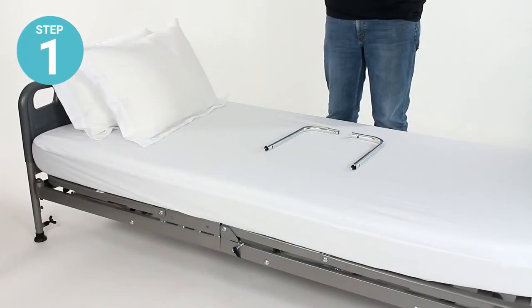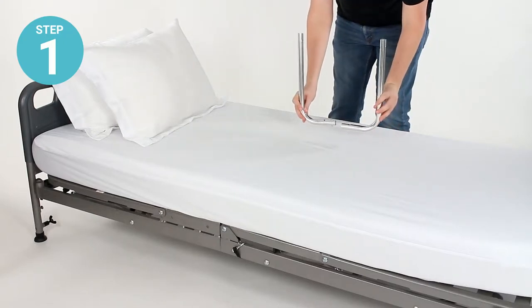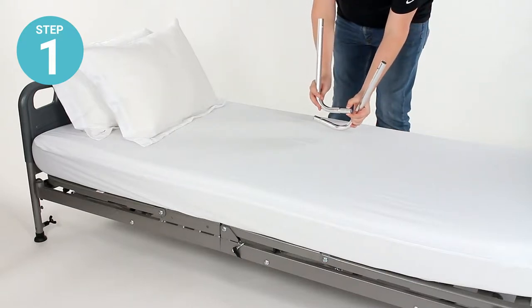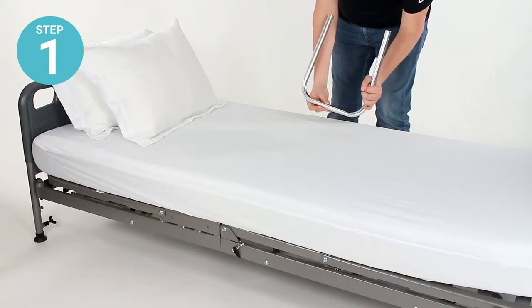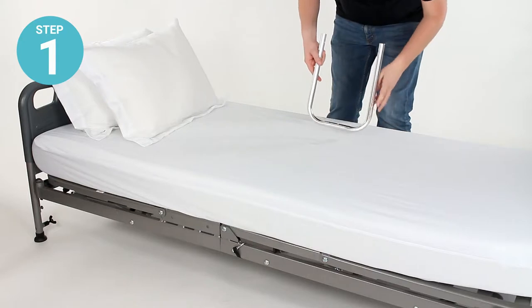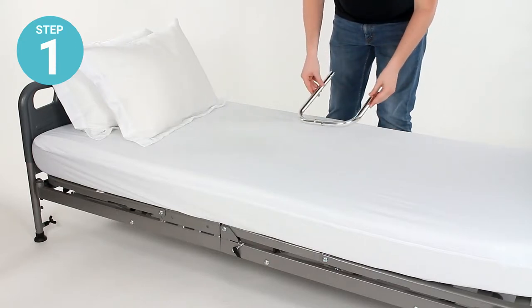Step one: fit the two L-shaped long base rails together using the locking pins on A1, the male end. You'll pinch those together and fit them into A2 until those pins pop into place. This will now form the base of the compact bed rail that fits underneath the mattress.